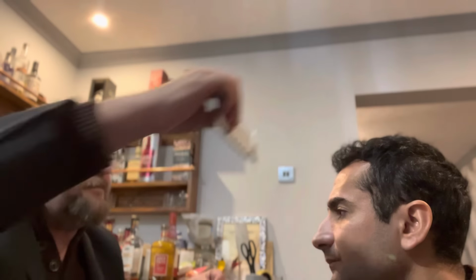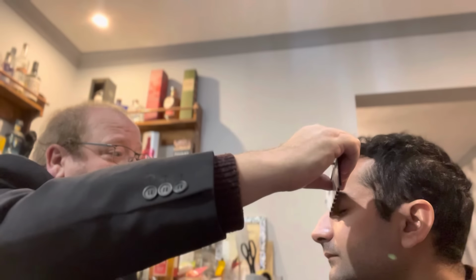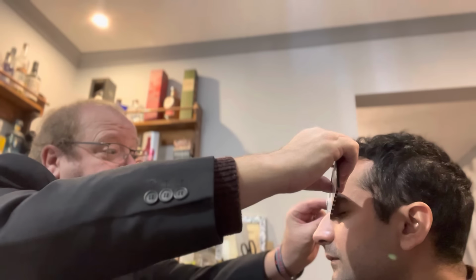And now I'll do it from the other side. I would expect this to be slightly bigger. So as I put this on, again I'm after the same 3 points of contact.